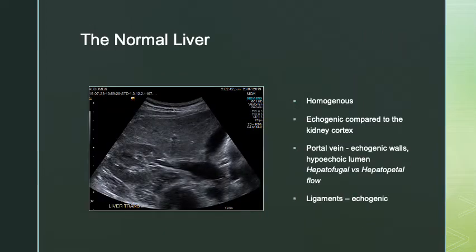When we look at our normal liver, the echotexture is quite homogenous. It tends to be echogenic compared to the kidney cortex. Our portal veins have echogenic walls with hypoechoic or anechoic lumen. The ligaments also appear quite echogenic on ultrasound because of the fibrous tissue they're made of. The walls of our hepatic veins don't tend to appear as bright as our portal veins.